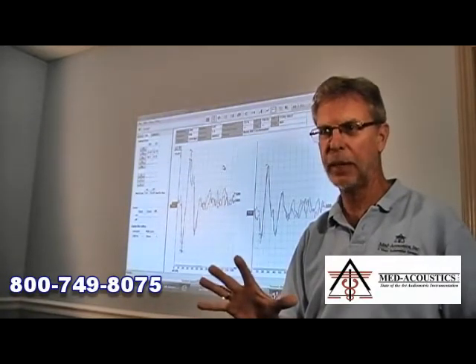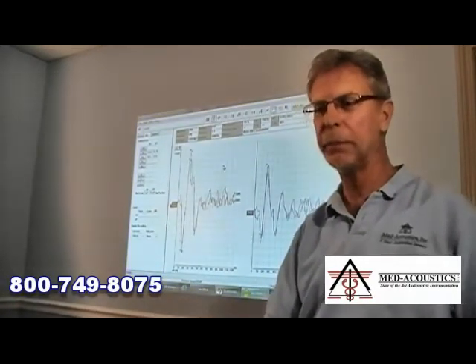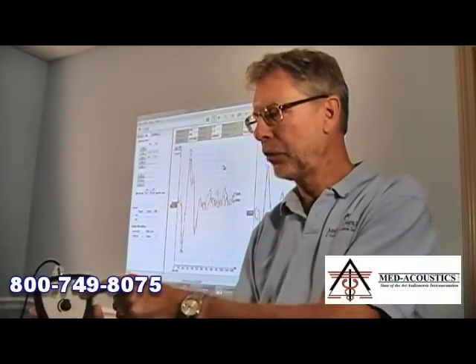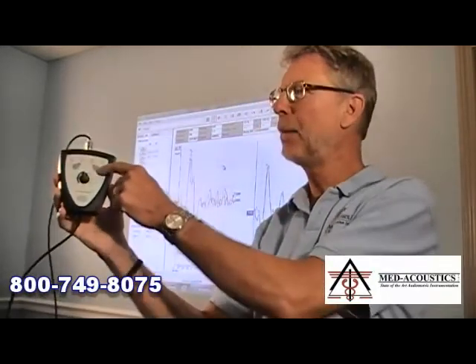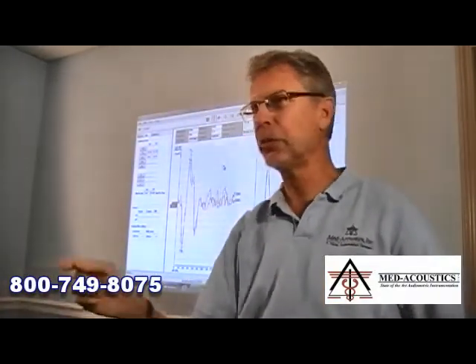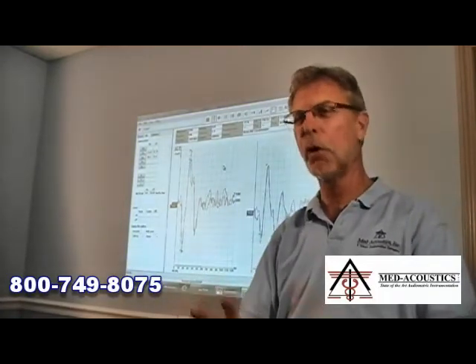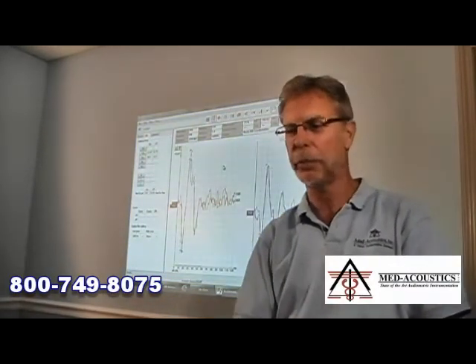Now, as you know, the FDA has not allowed any of the manufacturers in the United States to openly implement this function on their system. So unlike systems that are sold in other areas of the country, this button is marked minus 20 dB, meaning when you press this, the amplifier gain goes down by 20 dB. If this was sold in Canada or Europe or anywhere else in the world, that would say VEMP on it. Okay, but we don't say VEMP, we don't say the V word in marketing any of these products. However, nothing stops you as a clinician from doing this auditory evoked potential test.